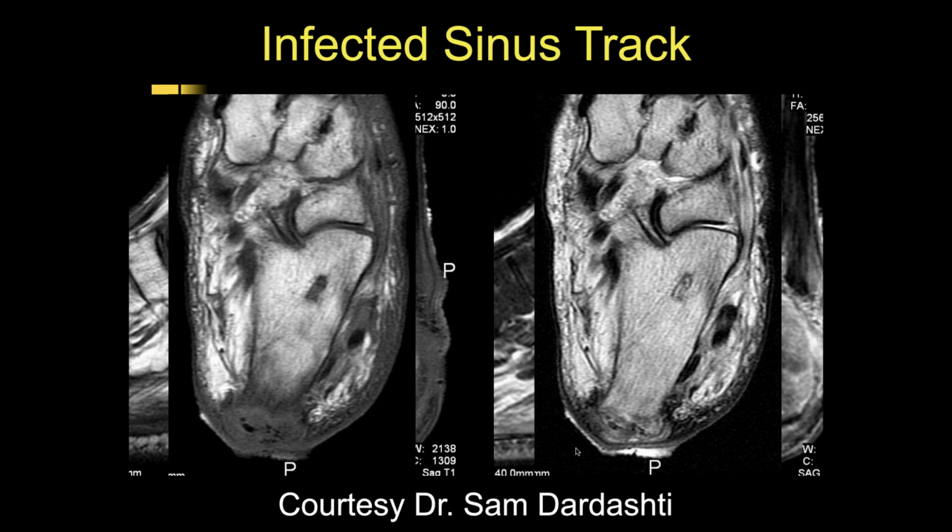It turned out in this particular case, this was a sinus tract. That might just be tracking in from the outside then. Probably tracking in through the sinus tract, but that's important to notice. Gas formers are not very common in diabetics for some reason.